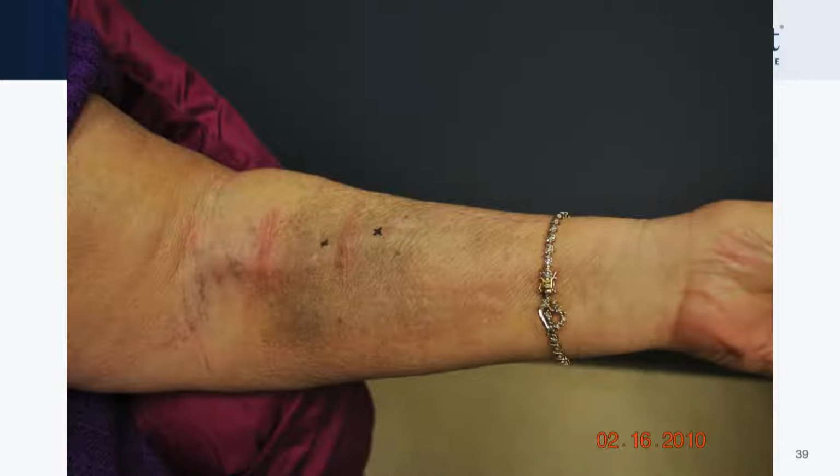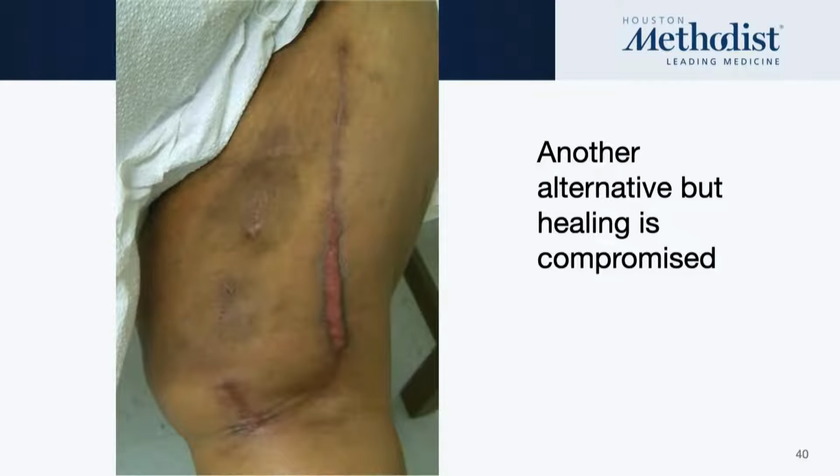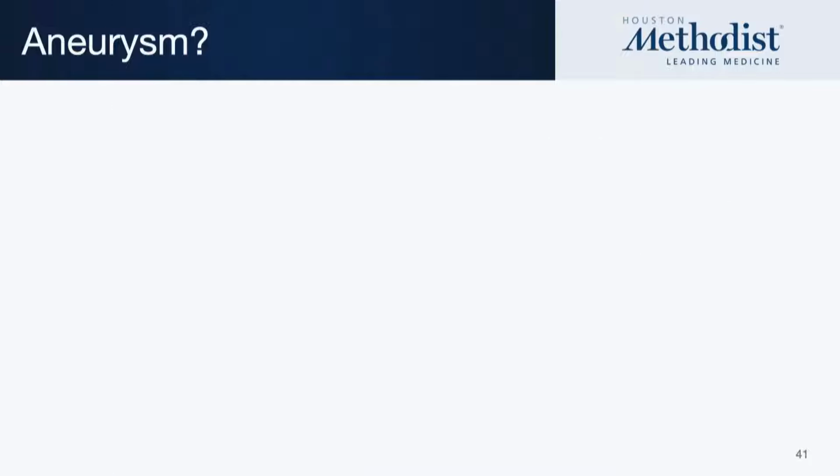And then here we've marked it in areas of tortuosity to try and help direct them in terms of where to puncture that. Previously we do these longer incisions, but those widen out and don't heal so well, so the lipectomy through transverse incisions or mobilization there we find to be really helpful.